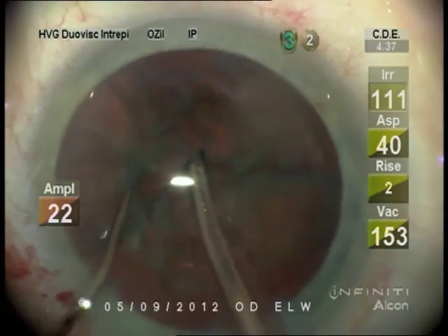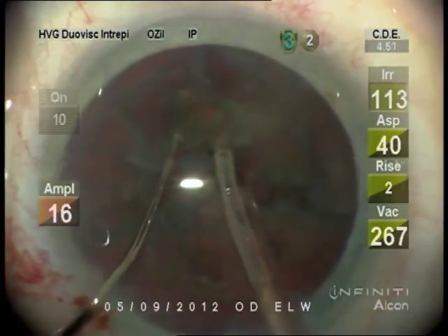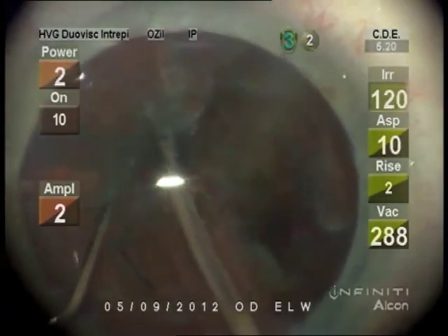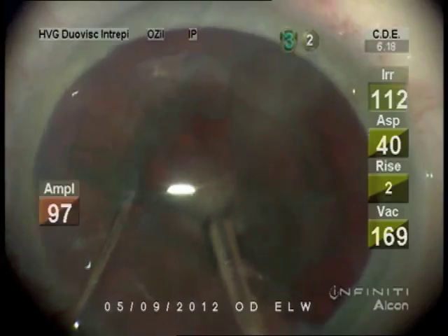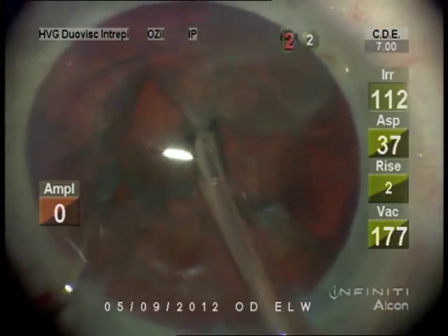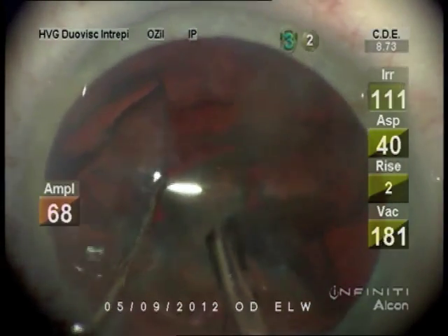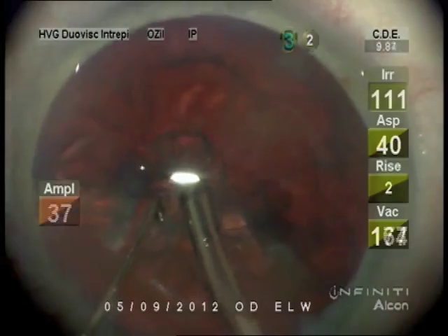That quadrant didn't tumble out quite as efficiently because it was a little on the large side. Better if they're smaller like this one. Well, we still have half the nucleus there. We can be much more aggressive.